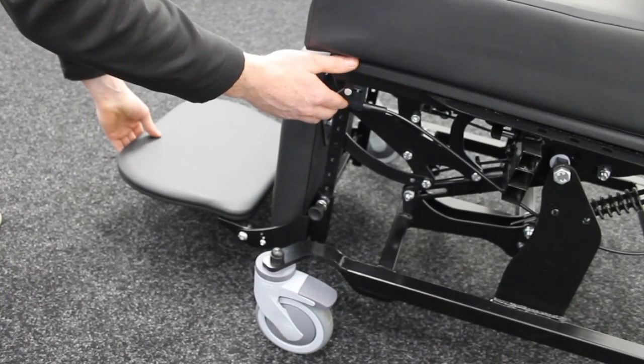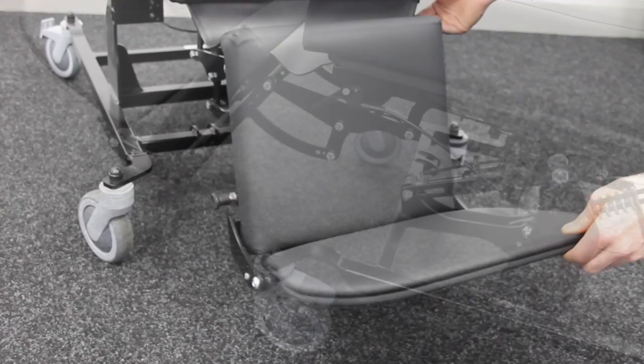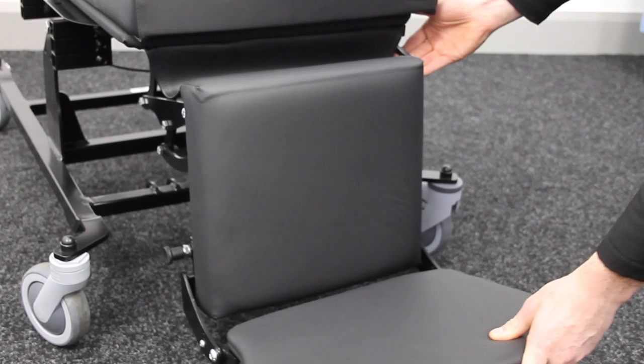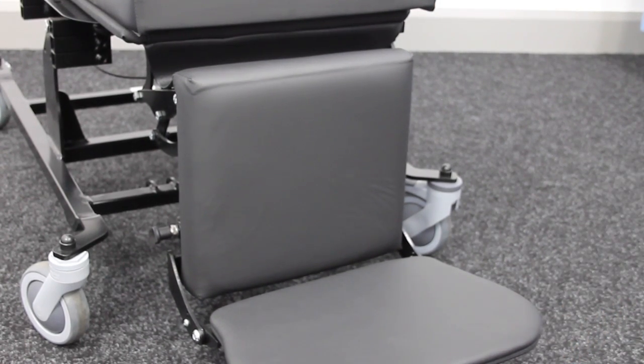To adjust the elevation of the leg rest, engage the manual lever cable on the left and adjust until in the correct position. To retract the elevating leg rest, activate the release cable and lever the leg rest in using the foot plate as shown.